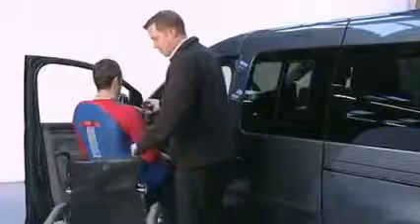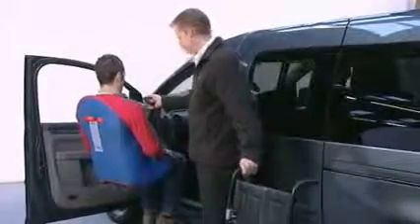The wheelchair can then be removed from under the person. The person's feet are then lifted into the footwell and they can be pushed forwards and then turned sideways over the seat of the car. They are then lowered onto the car seat using the remote control.